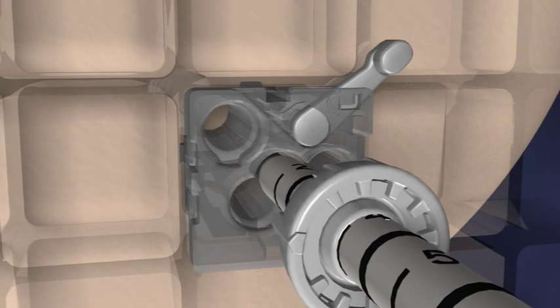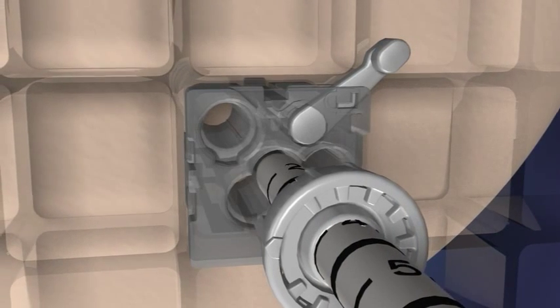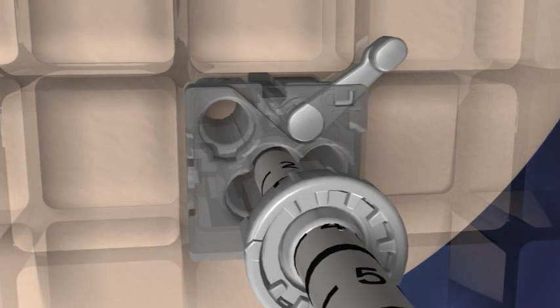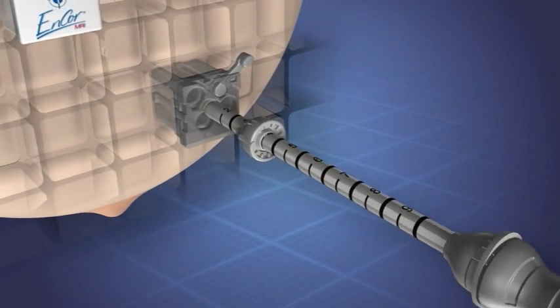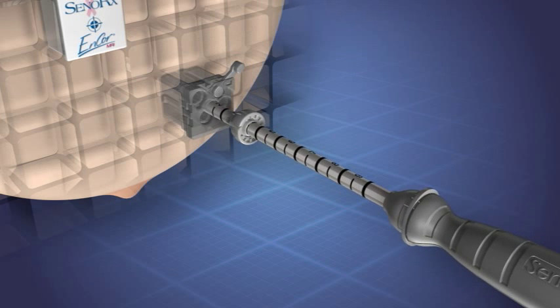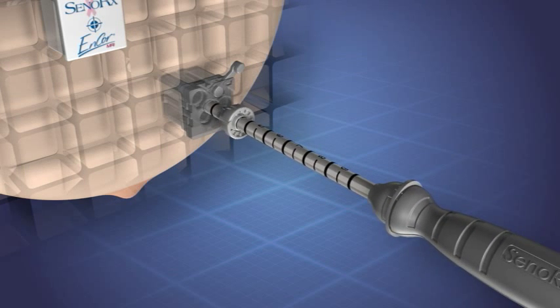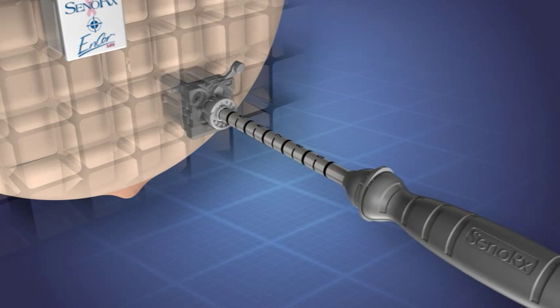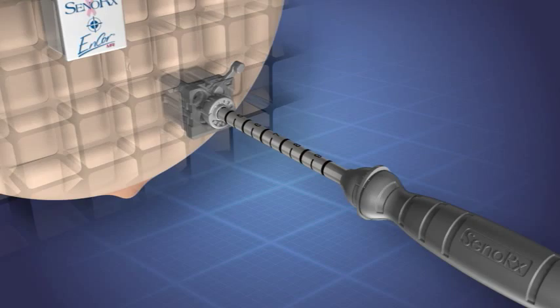The locking mechanism further stabilizes the block within the fenestration, providing for a precise and accurate trajectory to the lesion. The trocar is then advanced to the desired depth. To reduce pushback, a gentle clockwise-counterclockwise rotation of the trocar and cannula is performed during insertion until the depth stop mates with the locking block.